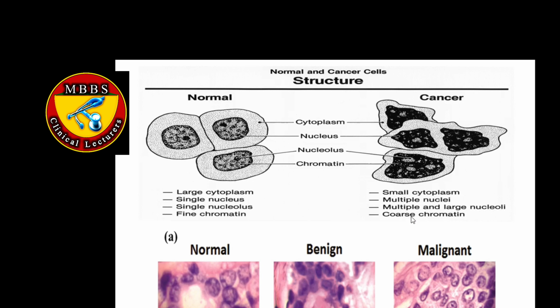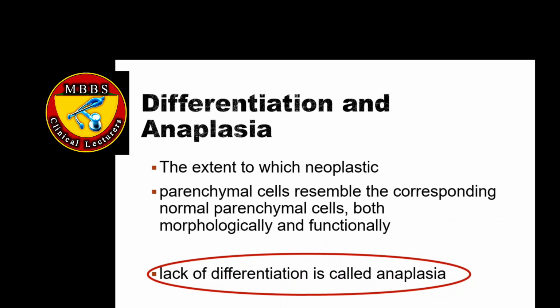and this becomes malignant. In malignant tumors, the cells have different morphology. The outer membranes are irregular. The chromatin is clumped, and you can see some of the cells are bigger, some are smaller, some are ovoid. I mean, there's no uniformity in the malignant cells.